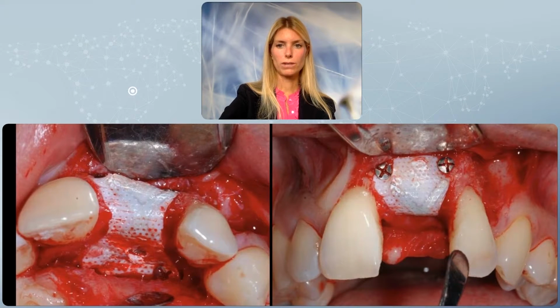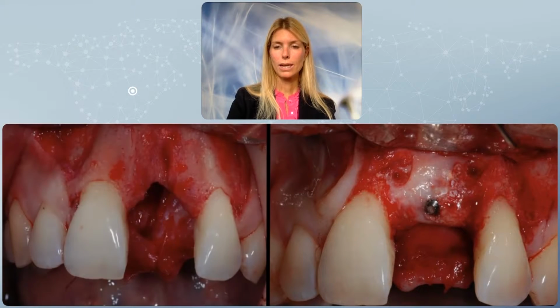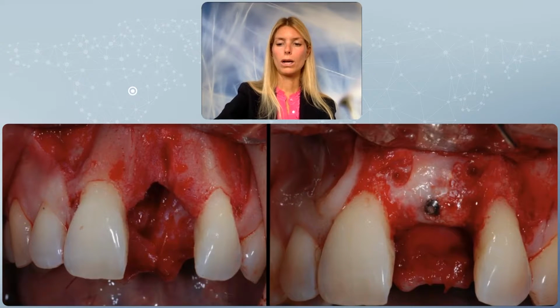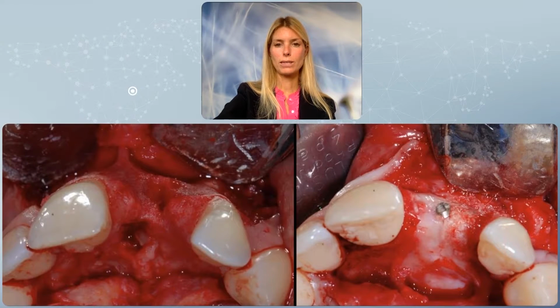and we can see the volume of bone achieved in the area, which is very much significant. You can immediately notice the head of the tenting screw, the umbrella pole that we've positioned, and we have resolved this case, and we have transformed a quite challenging scenario into a clinical situation where you have enough bone to position your implants in the correct 3D positioning. And you can see the before and after even from an occlusal point of view.